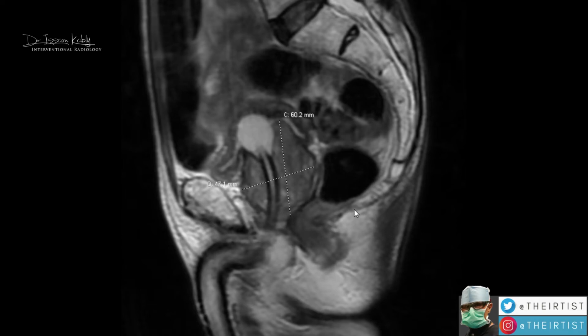So again, a quick note here, the most accurate way to measure the prostate is by imaging. We use either software called segmentation software, or like here we use just an ellipsoid formula, as opposed to a urologist, who uses only his finger through the rectum, which grossly underestimates the volume of the prostate.